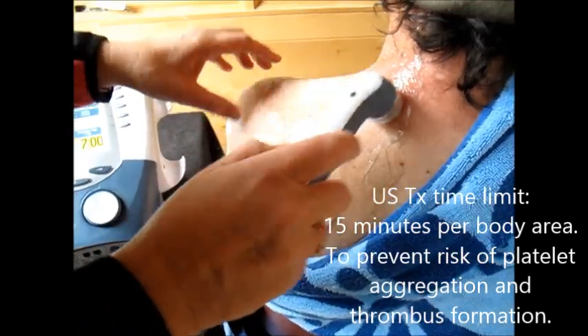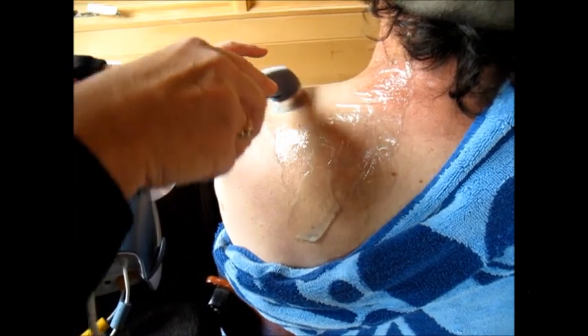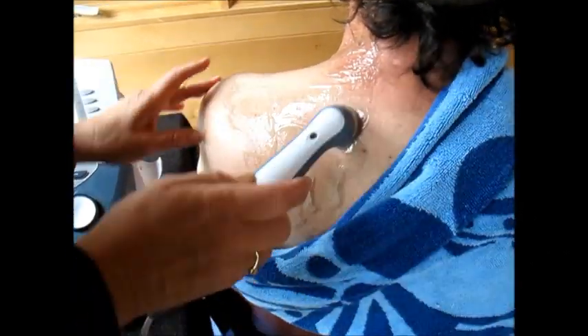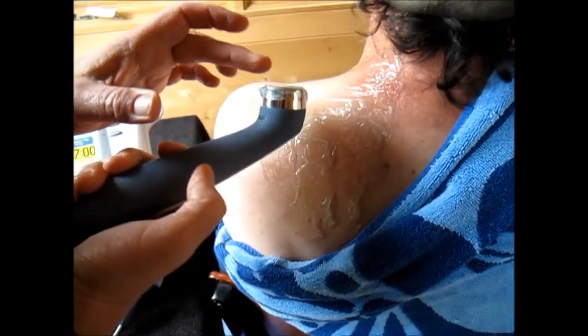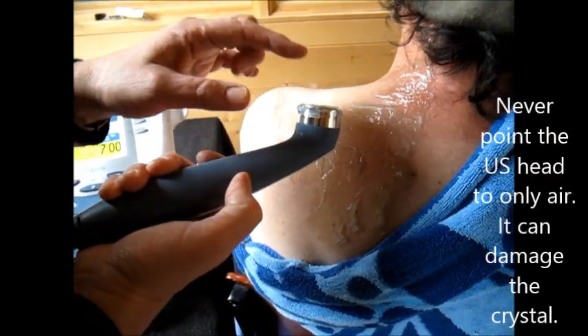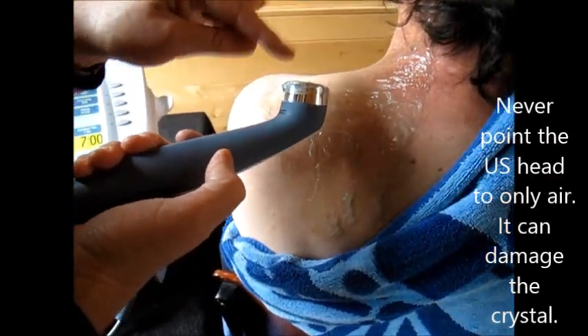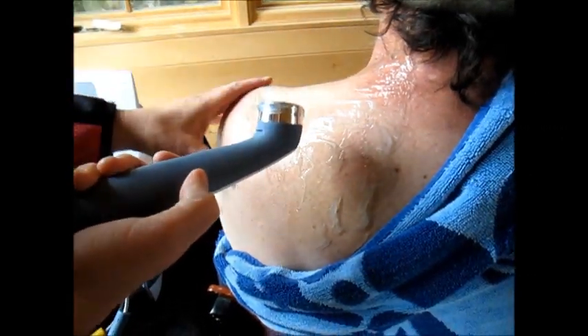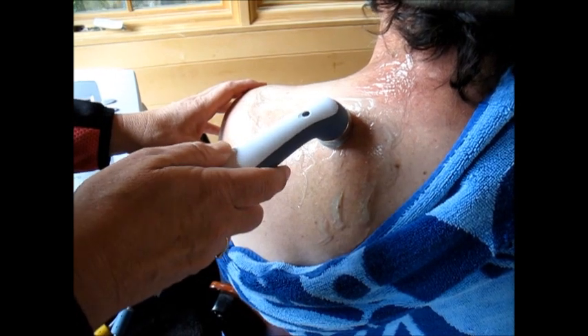You can see the light is not on, so it's not actually running ultrasound — I'm not breaking the ultrasound head. If I take the ultrasound head off the patient, I can actually break the crystal because the vibration is hitting nothing, like hitting a glass that has no liquid in it. So you want to be in contact at all times.